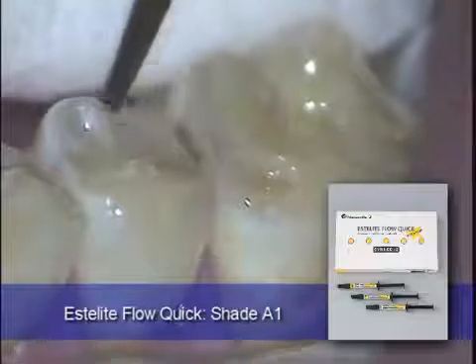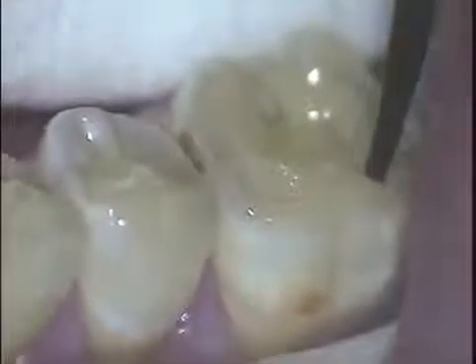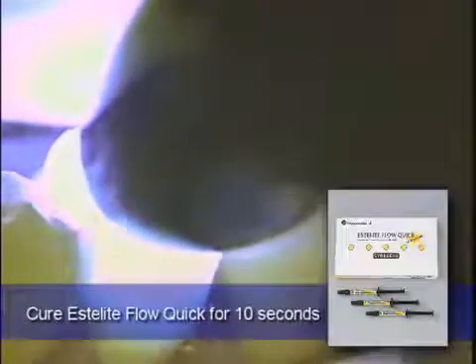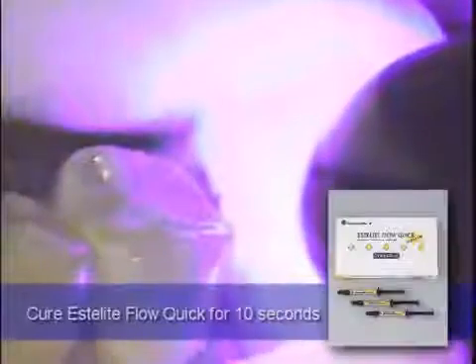Another 2 mm increment is placed in the cavity preparation, and is then cured for 10 seconds. The occlusal portion of the cavity preparation is filled. Cured for 10 seconds, it is finished, the occlusion checked and adjusted, and polished.